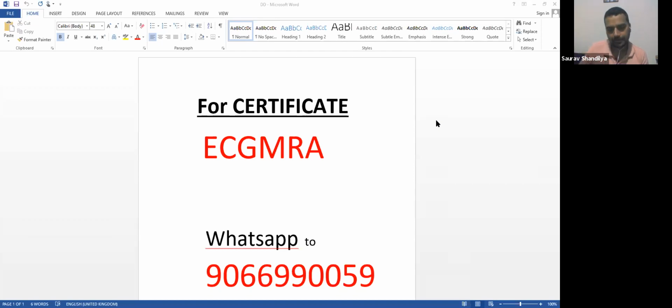between 2 R waves. Now, that is the rule that goes for the normal ECG. When it is an abnormal or irregular ECG, the rule changes. There you have to multiply 10 with the number of R waves in a 6-second ECG. So you have a mark on the 6-second ECG, and you have to see how you can do that.